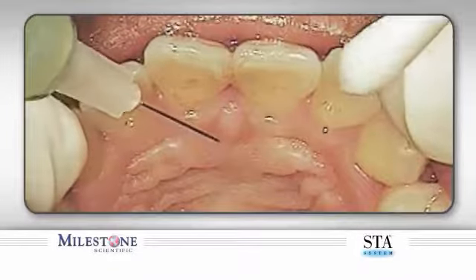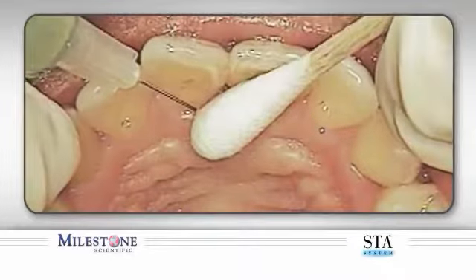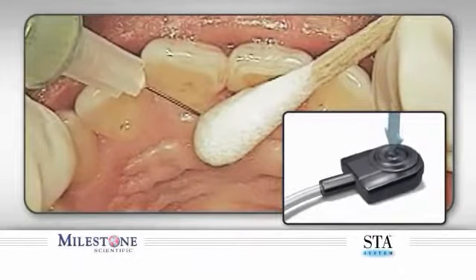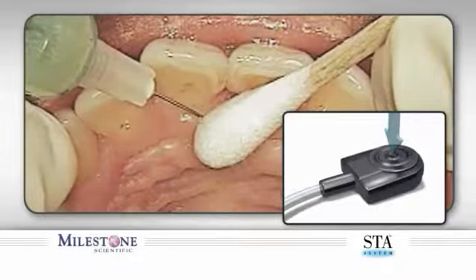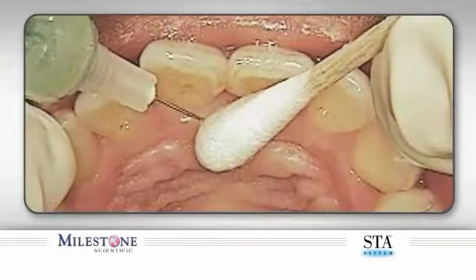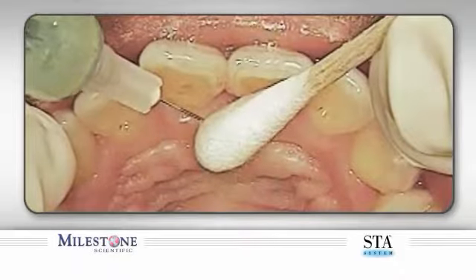You can see the needle is applied to the surface of the palate, followed by the placement of a cotton applicator. The flow of anesthetic is begun by initiating the STA cruise control. Once the needle bevel enters the tissue, pause forward movement for an additional 4 to 5 beeps before advancing again. Next, simultaneously advance the needle 1 to 2 millimeters while rotating back and forth birotationally.